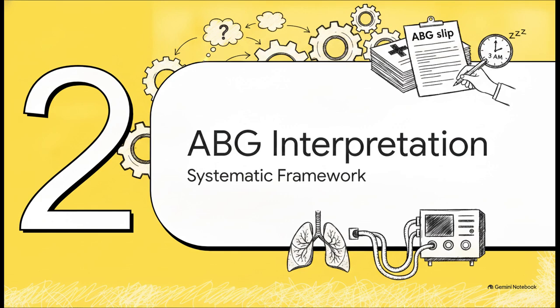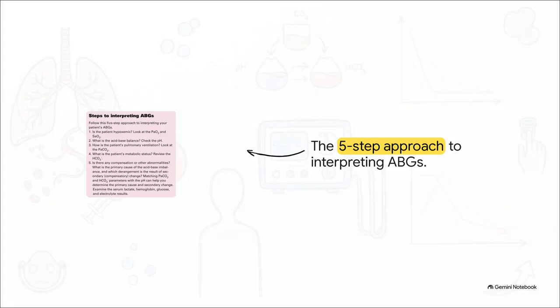Moving right along to Section 2, Systematic ABG Interpretation. Because knowing your tools is only half the battle, now we need a diagnostic framework. You definitely don't want to freeze up when a nurse hands you a freshly printed complex ABG slip at 3 a.m., right? Notice how this 5-step approach simplifies interpretation into highly logical steps.